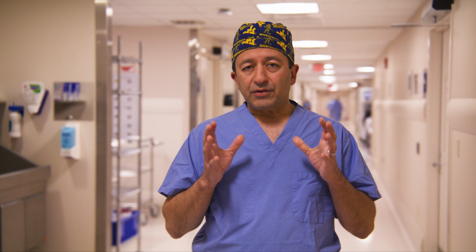So now we've seen how to perform even more complex RAVR in the setting of heavy calcification. What about the patient now who has a small annulus or has the risk of patient prosthesis mismatch? These are situations where we need to put the largest prosthesis possible. So join us in our next episode where we're going to show how to perform root enlargement at the time of RAVR.